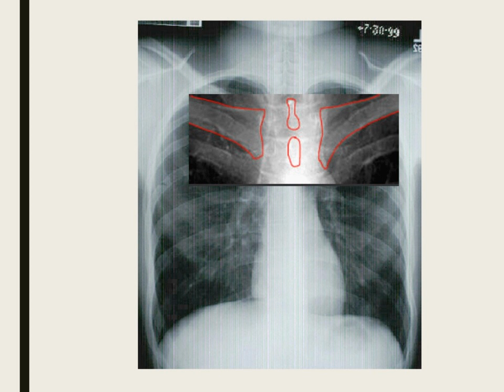If people are rotated, you're going to be shooting different angles. If you rotate one side, the distance is going to be much smaller than the other one, right? So if you are asking for an X-ray, an X-ray is done, an X-ray tech comes up, and you're looking at the monitor on the X-ray machine and you see things being kind of off, it's okay to shoot another one.